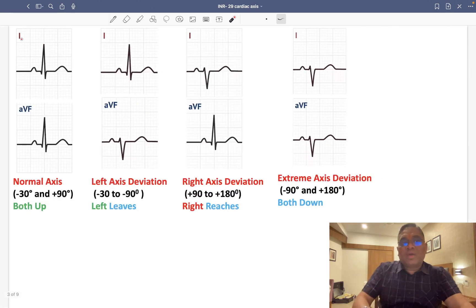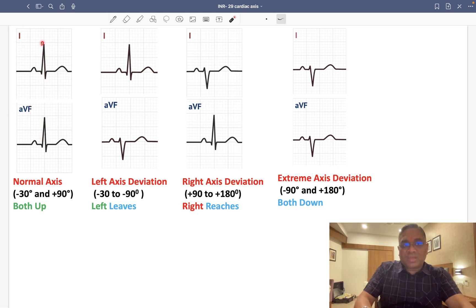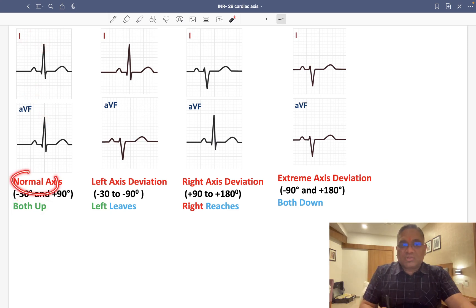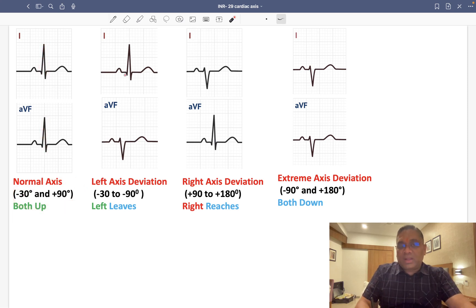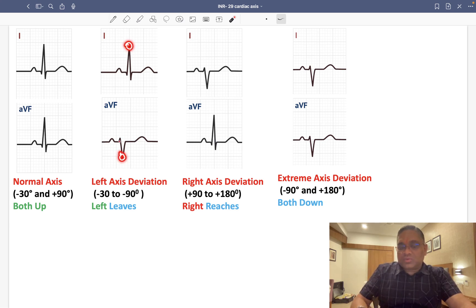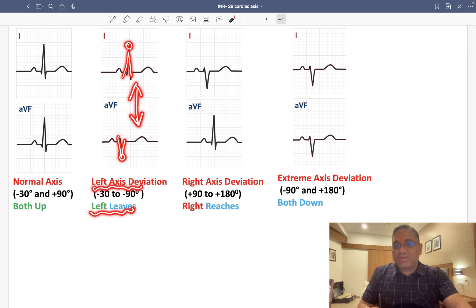We can remember these patterns using a mnemonic. When comparing lead 1 and AVF QRS tips: if both QRS complexes are going up — both up means normal axis (minus 30 to plus 90 degrees). When you see left axis deviation, remember 'left leaves' — the tips of QRS in lead 1 and AVF are pointing in opposite directions, away from each other.